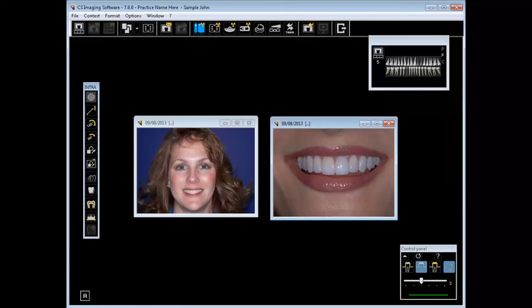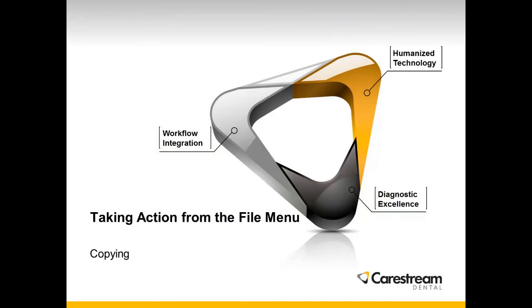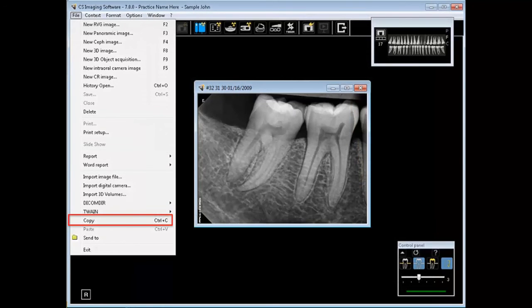Taking action from the File menu Copying. With an image open, you can select File Copy.